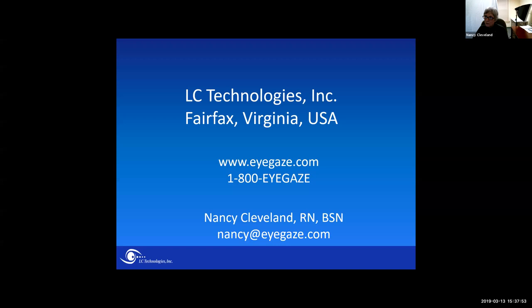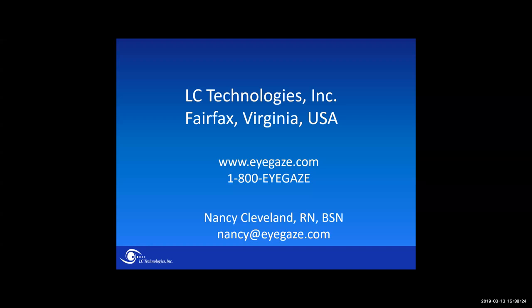The connection looks like a couple of USB sticks but they're not — they're called edge links. You plug one into your iGaze system and the other into the computer you want to control, either Windows or Mac, and that's it. With computer control it acts as a remote mouse. So if he was writing an email, he'd be typing on the eye gaze screen — everything he types appears above the keyboard on the eye gaze screen and simultaneously appears in the body of the email on the other computer. If you want to see the whole output, you just glance over to where that screen is.